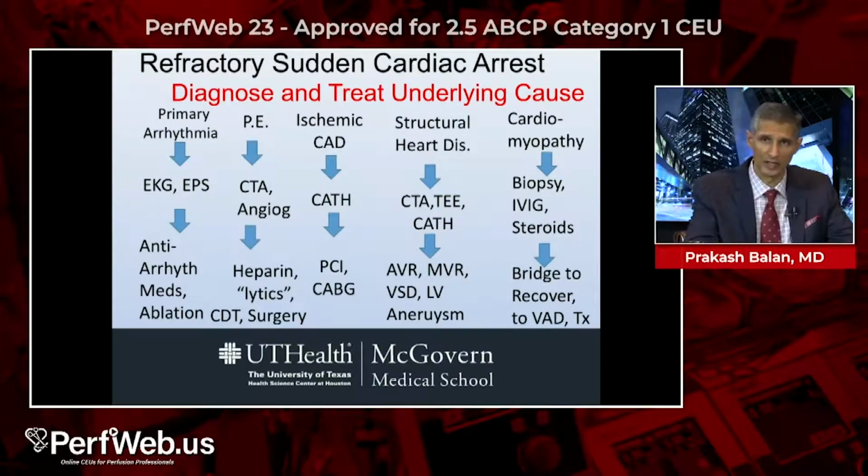Ischemic heart disease, a lot of what I do, patients who present with ST elevation MIs complicated by VFib, if they are in profound states of death and shock, oftentimes ECMO provides you that opportunity to revascularize percutaneously or otherwise so that you can reestablish life. Structural heart disease, another big area of interest for me, particularly aortic valve disease. Absent support, sometimes it is difficult to have the time to get these patients to a definitive therapy, whether that is surgical valve replacement or percutaneous valve replacement.